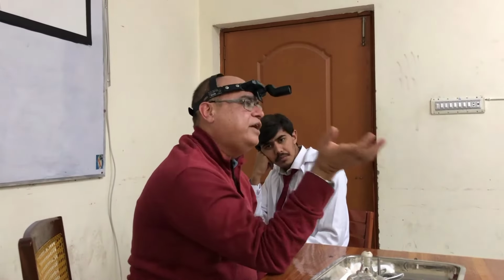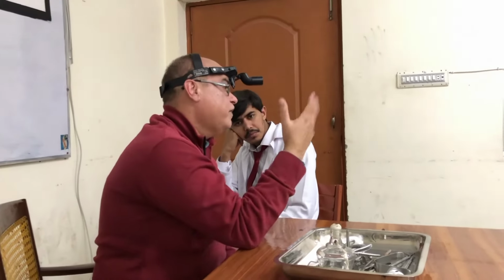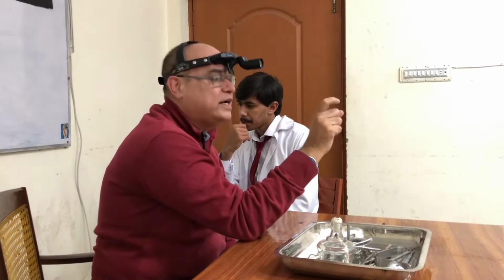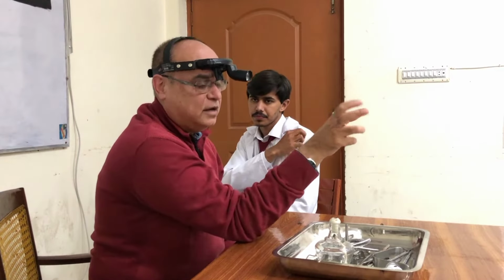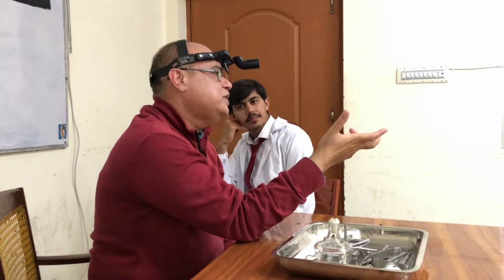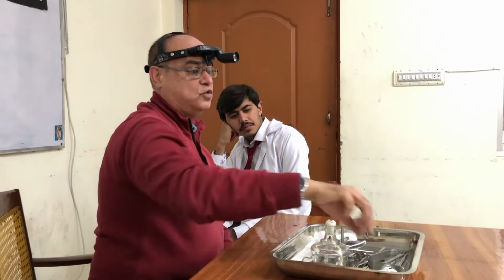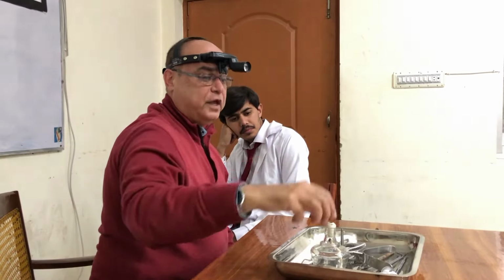But before the advent of nasopharyngoscopy and even CT scan, it was a literally difficult examination to look at the nasopharynx. But still, they do ask you in the examination, and as a step, you have to know how we can do posterior rhinoscopy.